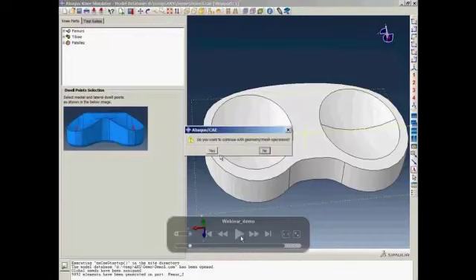Next, the GUI asks whether the user would like to continue with the geometry and meshing operations. The reason we provided this option is just in case you are importing a part that has already been meshed. In that case, you can skip this step.